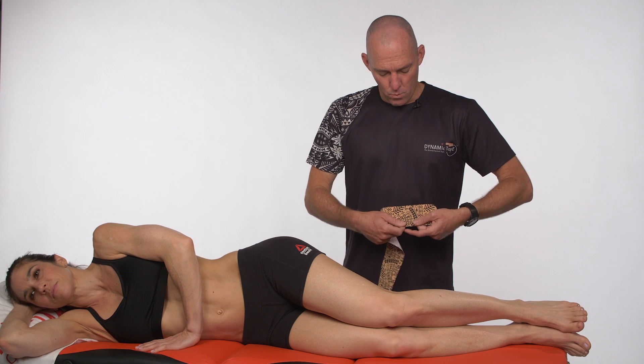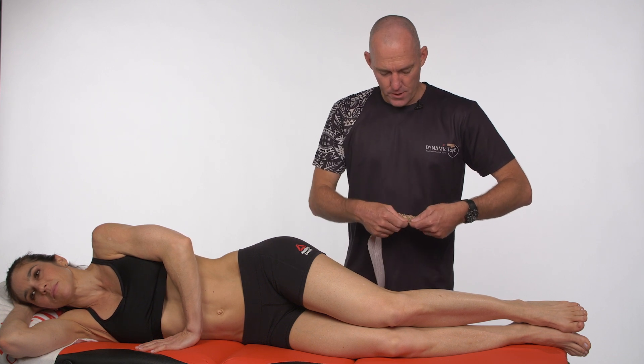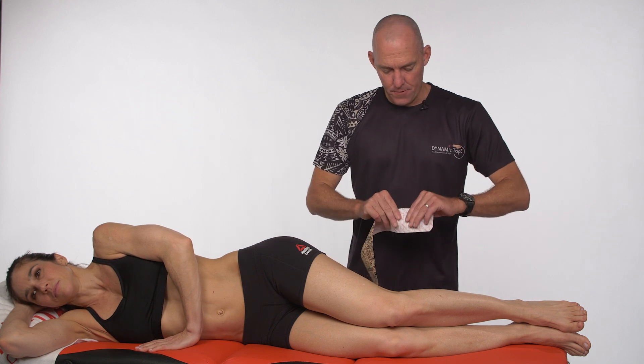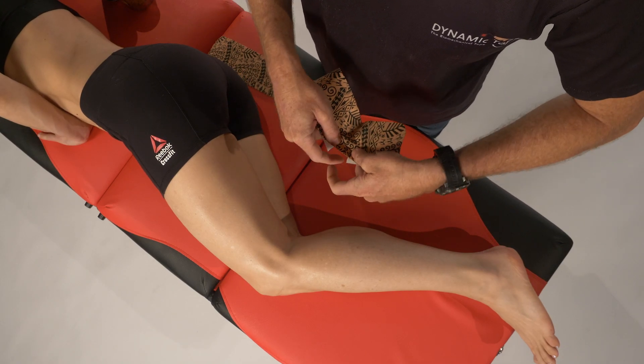We're using the wider tape. We're covering quite a few joints here, and we really do want this energy storage and release, so we're going for the original tape that's got that stronger recoil.